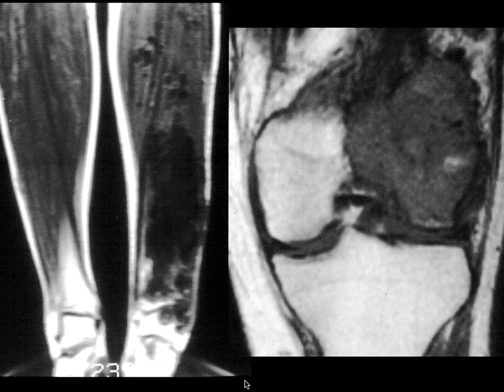And we know it's very good for looking at anatomy, especially the musculoskeletal system, and for blood. T1-weighted images are also very useful for IV contrast. Most of the IV contrast we use selectively shortens T1 times. Therefore, with the T1-weighted image, we can best differentiate between tissues with normal T1 times and those tissues that have shortened T1 times because we've given contrast. And they become bright because they have short T1.